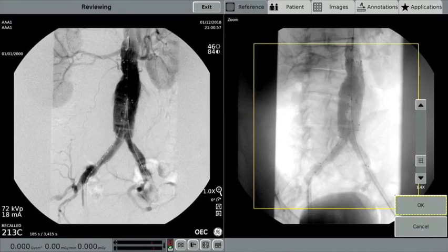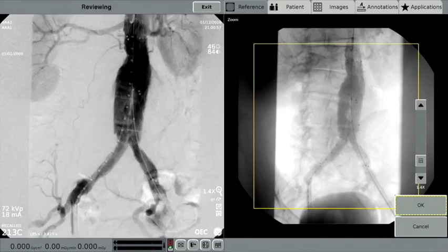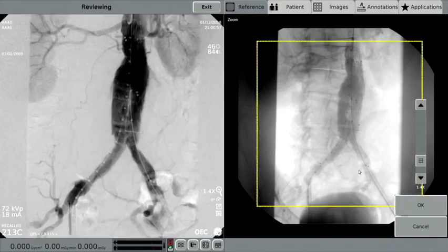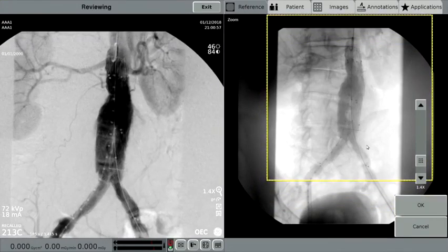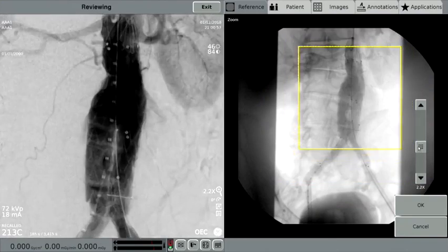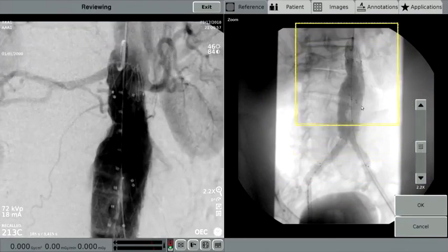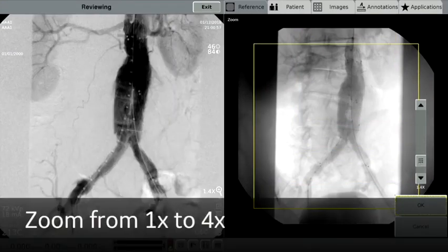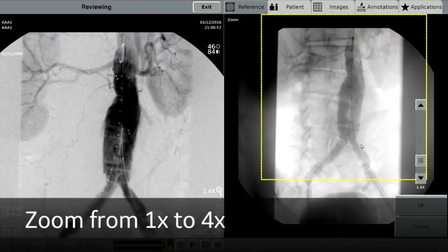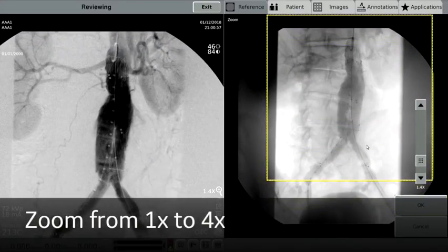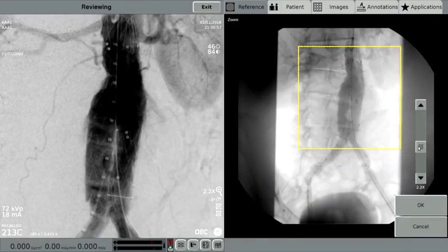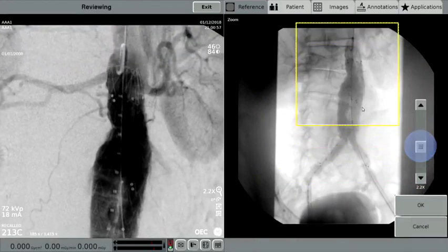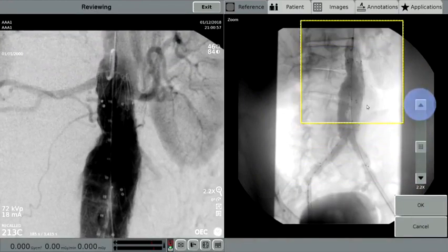In this example of an AAA, a surgeon may be interested in zooming in on an area of interest. When the Live Zoom button is selected on the workstation, the yellow box may be panned around to the desired area of interest. The image can also be zoomed up to four times larger. Live Zoom enables users to easily select from one to four-time zoom setting with the slider scale or up-down arrows.